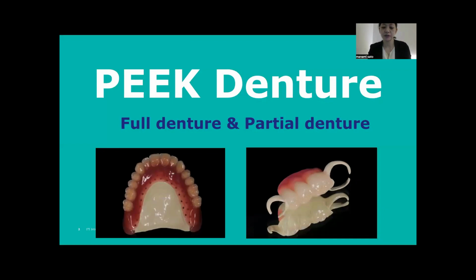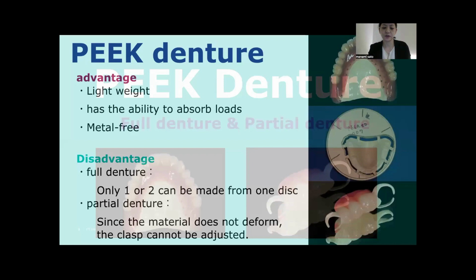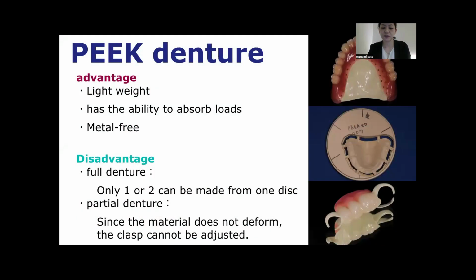First, the case of PEEK dentures. Let's talk about the advantages and disadvantages of using PEEK dentures. Advantages are lightweight, ability to absorb load, and metal-free.